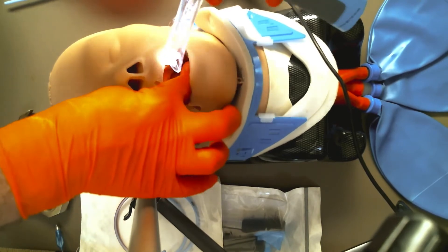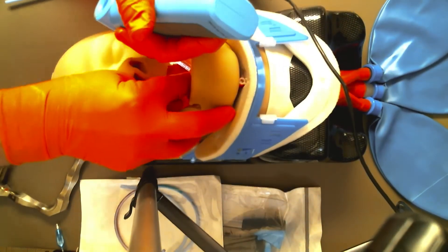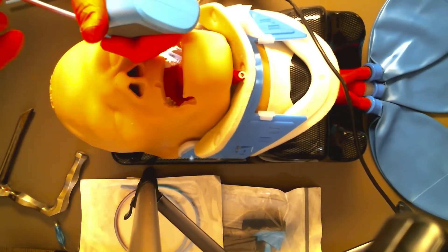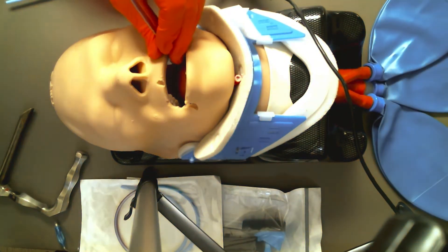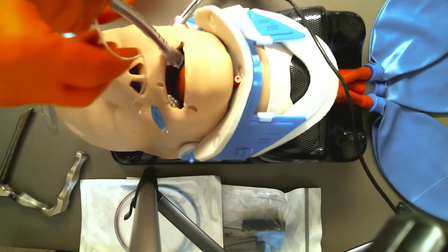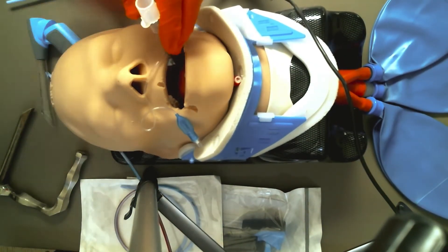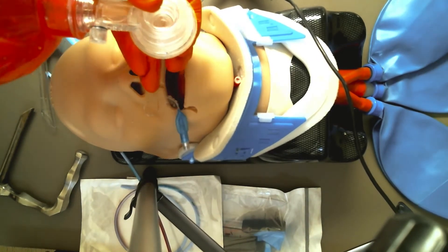Scissor technique — corner of the mouth, bypass the molars, visualize the vocal cords in seconds, pass your bougie, remove the V-scope, follow your standard protocol with your endotracheal tube, and inflate the cuff.